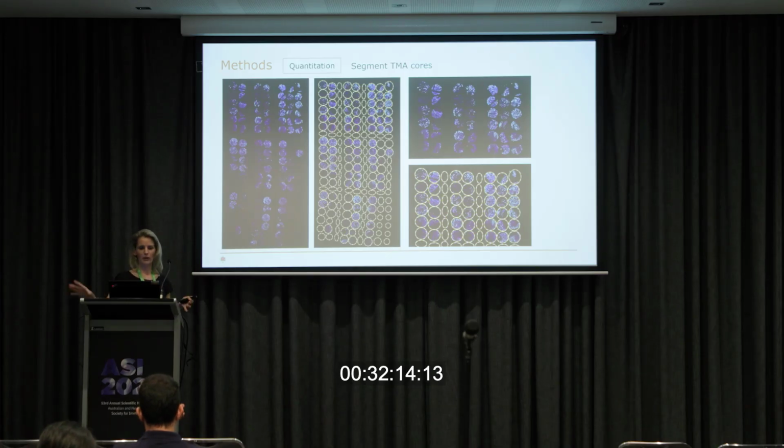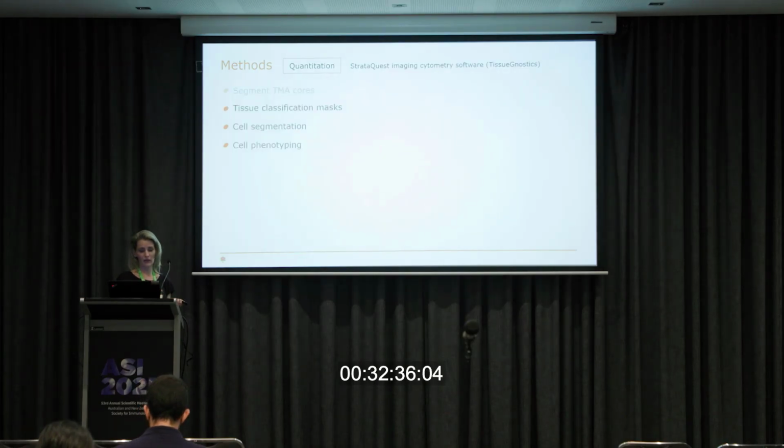So usually I'll put a rough grid on and then I'll spend a couple of minutes adjusting, going through and checking everything, and on we go. What these regions mean is that you can apply an analysis for the whole slide, but it will export the data for each of those regions so that you only get the data for that core, which is really neat, so we don't have to try and work that out down the track.